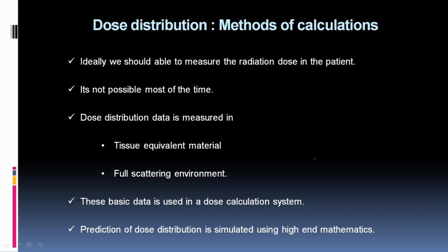So, what we do is we measure the dose distribution and produce the dose distribution data in tissue equivalent materials, not in patients, which give the full scattering environment.